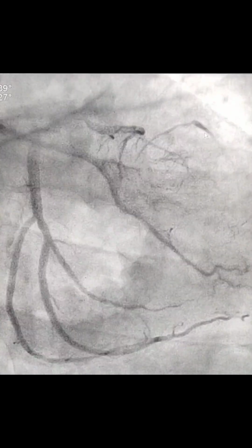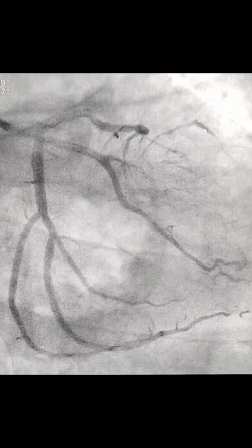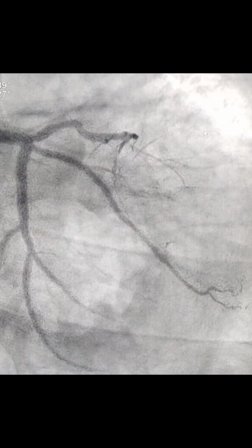So this is a 68-year-old patient who is a known chronic smoker, alcoholic, and diabetic, and he underwent coronary angiography five years ago, as he had unstable angina at that time. That coronary angiography showed a mid-segment LAD CTO, as you can see in this present angio.